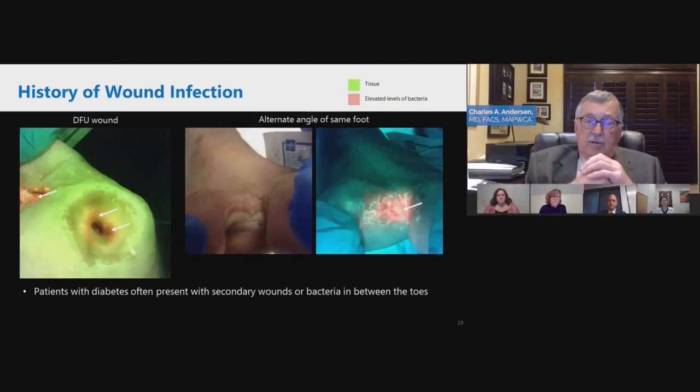Again, I work in a limb preservation clinic, and when we're focused on a wound, just like you said, after we have scanned that wound, we will just take that scanner and scan both feet. And it's amazing what you see. We look between the toes, and oftentimes we will see a fissure that you don't recognize clinically. A little silver alginate between those toes, maybe you've prevented something. The other interesting thing is many times we'll have a patient present with a diabetic foot infection with no obvious wound as a source.